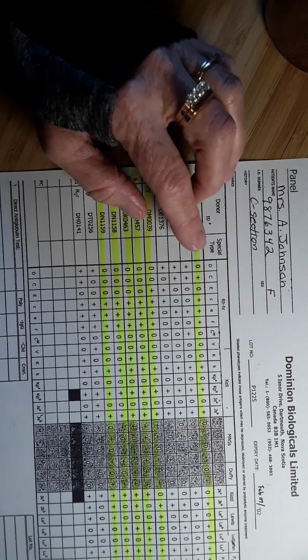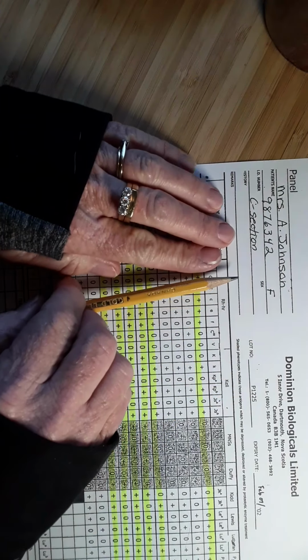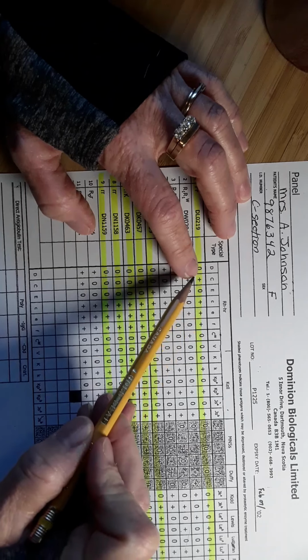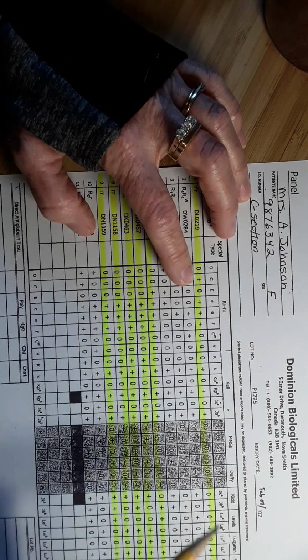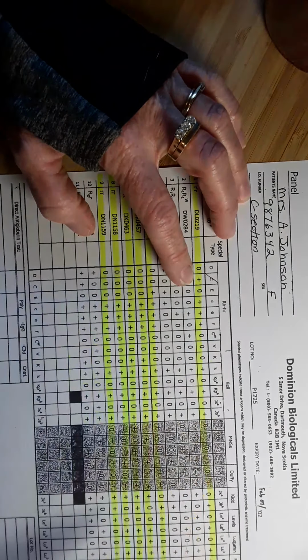On to C. So I'm looking at the big C. I'm not looking at everything else, you guys. I'm just looking down this column where it says big C. So I've got a positive big C cell that did not react with my patient's plasma. So I am saying tentatively that the patient's plasma does not contain an anti-big C. Does that make sense to you?